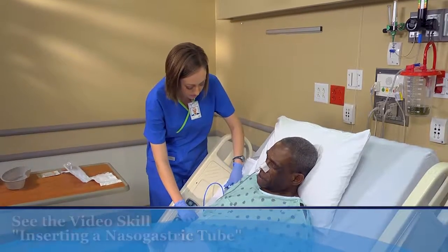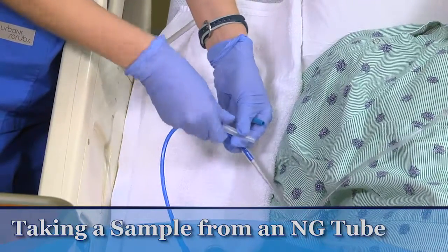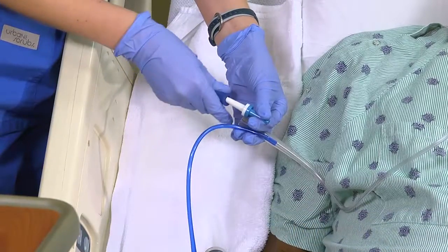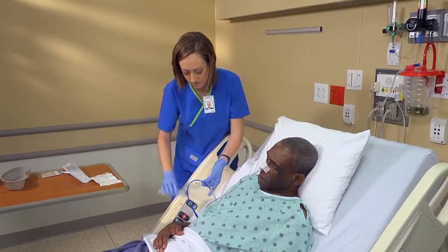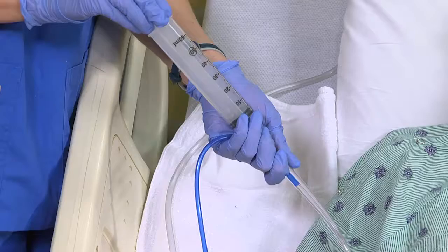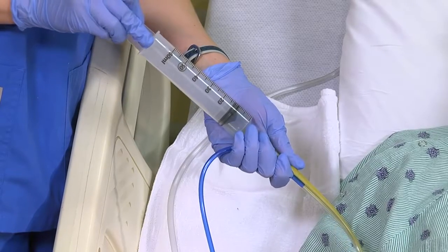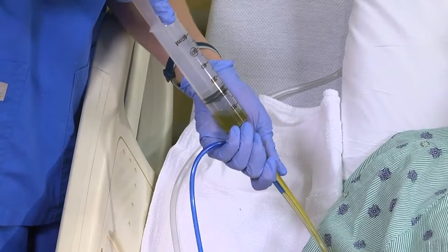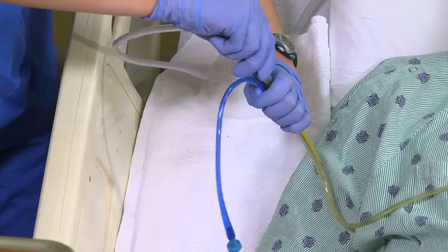To obtain a specimen from a nasogastric tube, first disconnect the tube from the suction or gravity drainage. Then, attach a bulb or catheter-tip syringe to the tube and aspirate 5 to 10 milliliters of fluid. If you find red blood or coffee ground material, report your findings immediately to the healthcare provider. Reconnect the tubing.